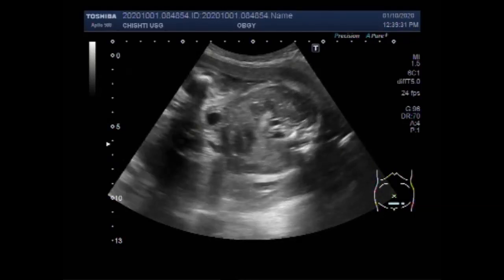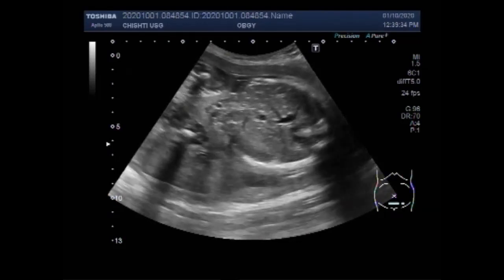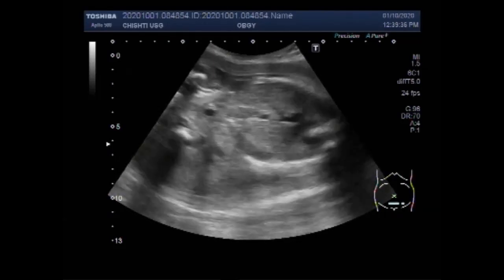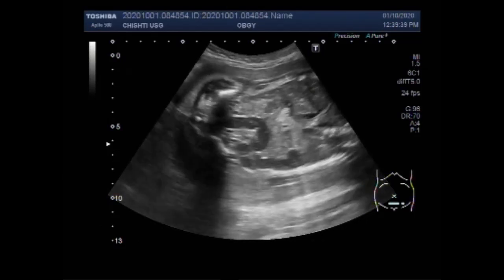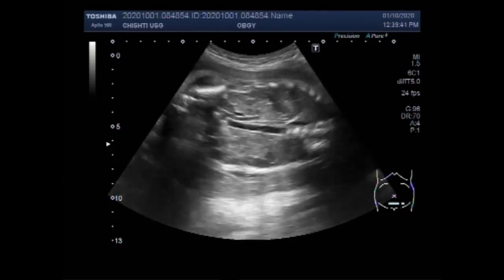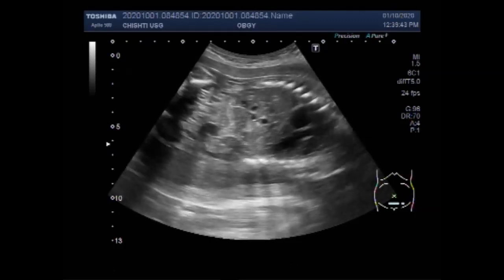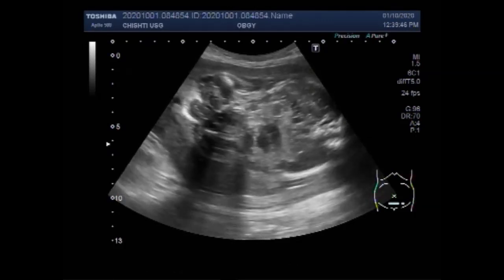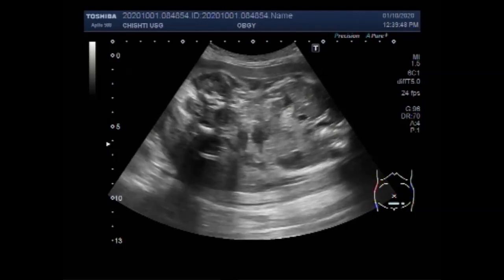You can see the fetal cardiac activity. Otherwise, there are no limb movements. The fetus is very sluggish with no limb movements.